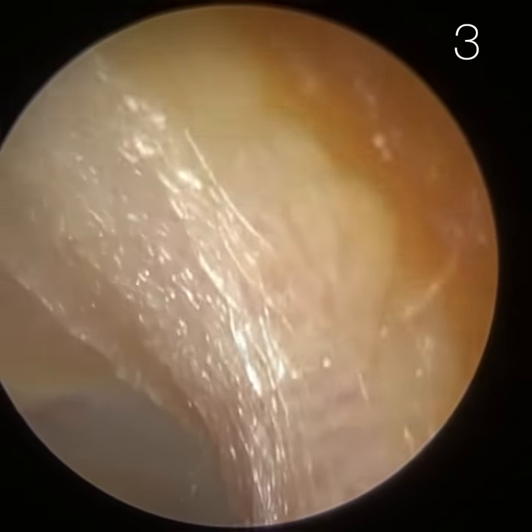This is another patient with quite soft, sticky wax and skin just at the entrance of the ear. Just trying to lift it away from the base of the ear canal — it's really got this adhesive property. There's a bit of dead skin on the right-hand side that's attached itself to the wax plug. Just manipulating this — it came out in a big plug, which is great. At the entrance there's quite a hairy ear. Some of these hairs are not always loose — they're hairs still attached to the outside part of the ear, above the cheeks, and they actually go into the patient's ear; the root is external but the tip goes into the ear.